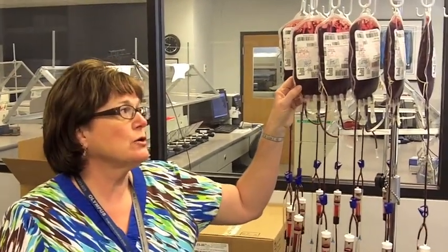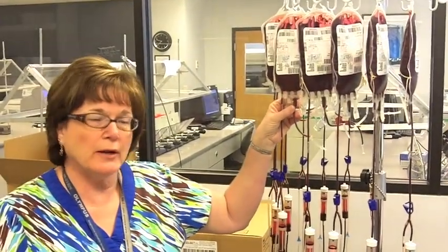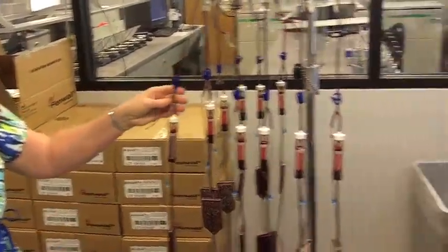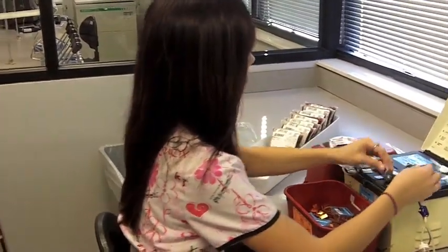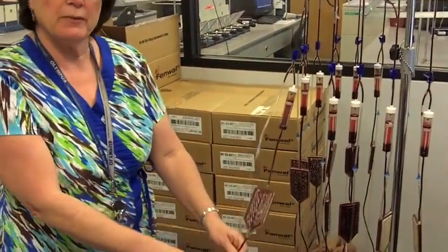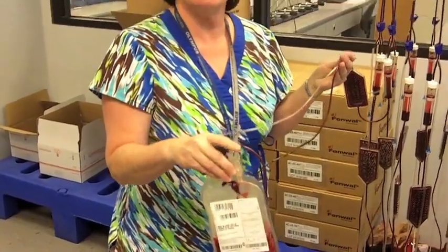Also at Blood Assurance, we do know that one of the main transfusion reactions caused from a unit of blood being given from a donor to a recipient are the white cells that are in the bag. So here at Blood Assurance, we have adopted the policy that we will remove those white cells as a standard operating practice. We take the original blood bag after it's been separated, and we sterile dock a new bag onto it, which has this filter. The blood will flow down through here, and all the white cells will be stripped out, and it will come out into this new bag. The blood that comes out here will be called leukoreduced. In other words, there will not be white cells present in this bag. Therefore, it will greatly reduce the chance of a transfusion reaction, which is a great safety feature for the recipient.